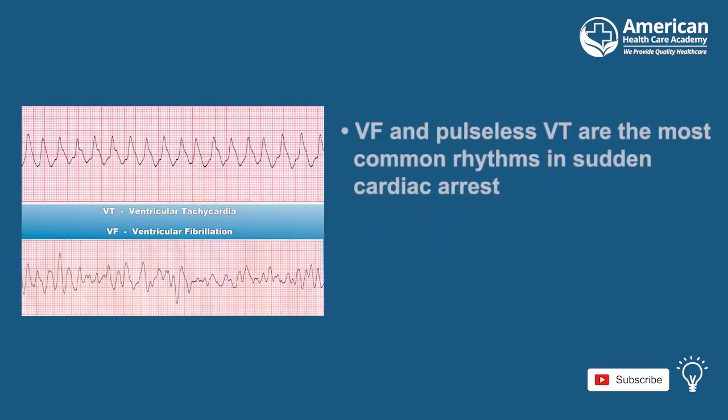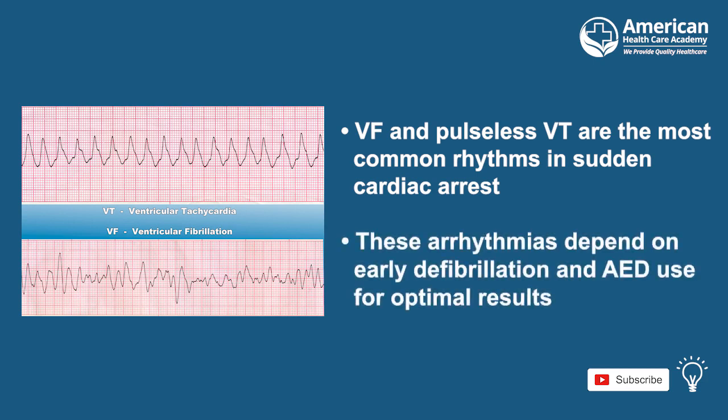The most common rhythms seen in sudden cardiac arrest are VF and pulseless VT, and because of this, early defibrillation and the use of an AED is critical to the survival of the patient when suffering from an arrhythmia.